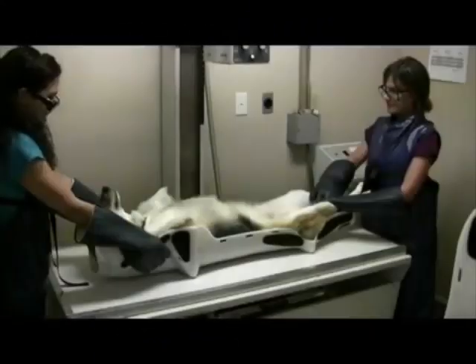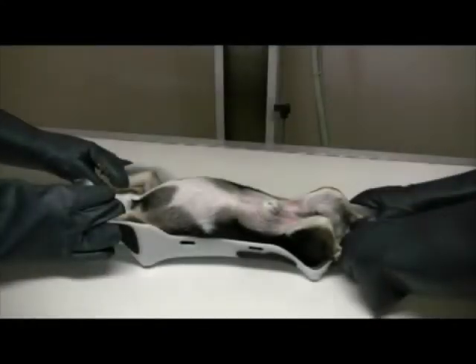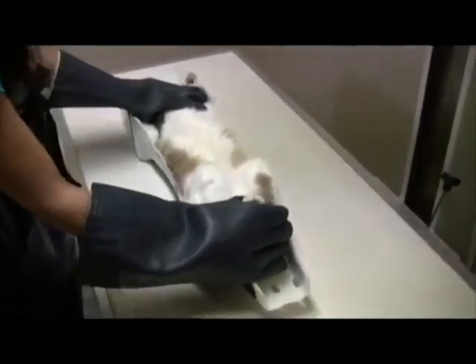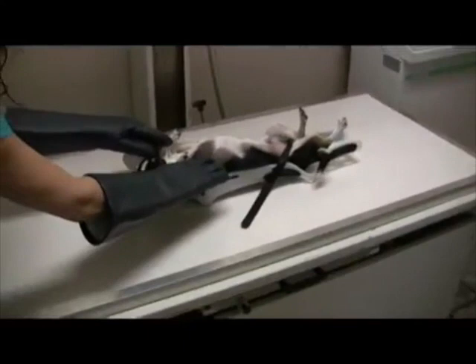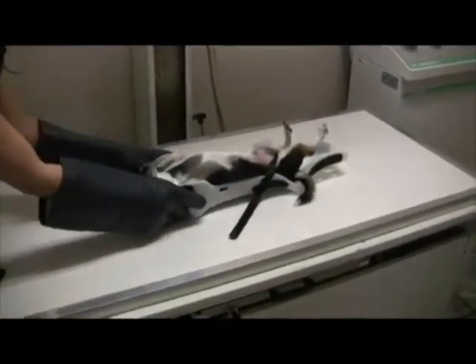The Positioner is also ideal for radiology, starting with its simplest application, a positioning trough. Because of our patented contour design, patients are better stabilized, remain closer to the table, and increase the distance of the handlers away from the source of radiation. In addition, a pelvic sling strap can be used with most patients so that the aft handler can leave the room entirely, reducing total exposure.